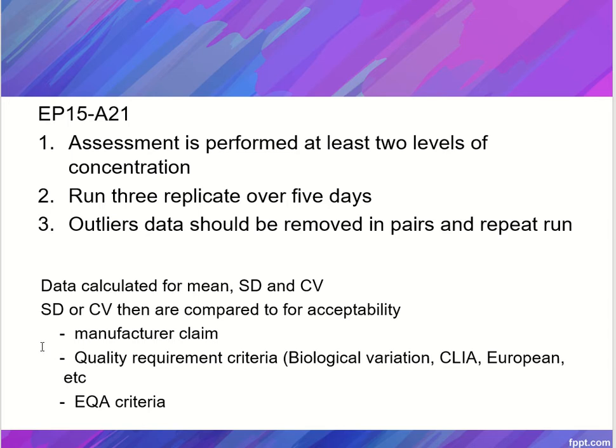Usually we use the manufacturer claim for the precision experiment. You can also use quality requirement criteria which I explained in part 1, such as biological variation, CLIA, European, etc. Or you can compare with the EQA criteria.